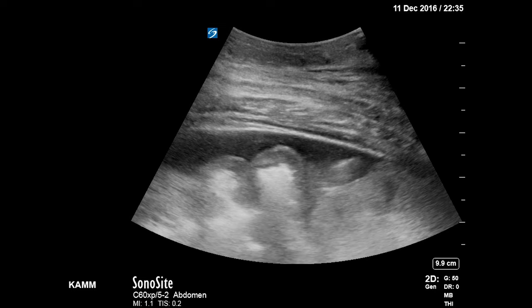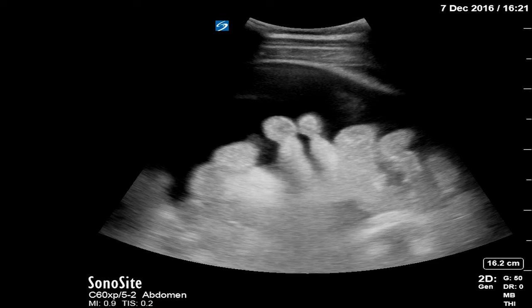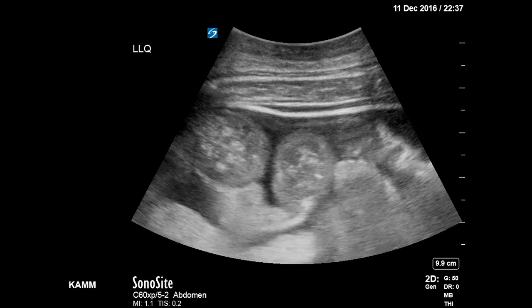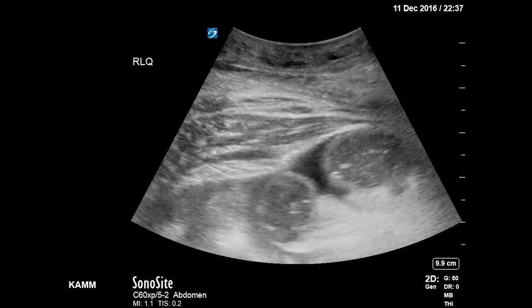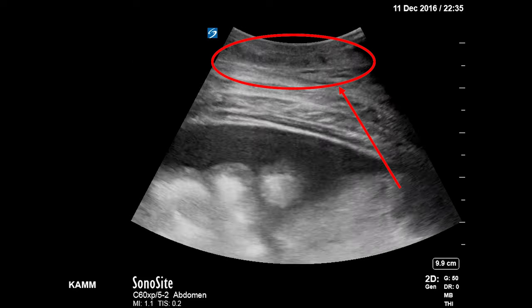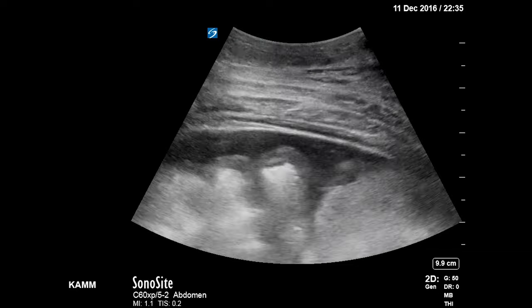Here the ascites is denoted on the ultrasound image where the dark space appears to have the intestine floating in it. The dark space is the ascites fluid pocket that you will be aiming for in your paracentesis. Also be sure to examine the skin's surface to make sure that there are no vessels in the site that you will be penetrating.